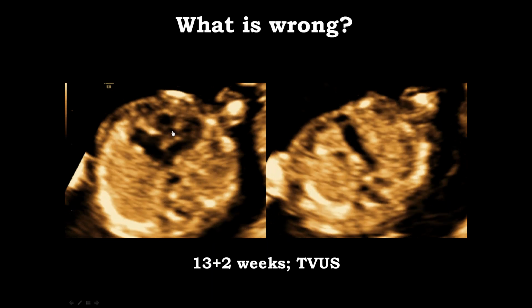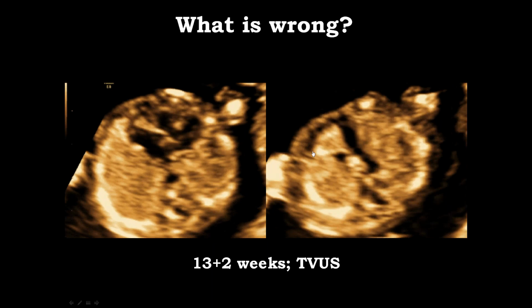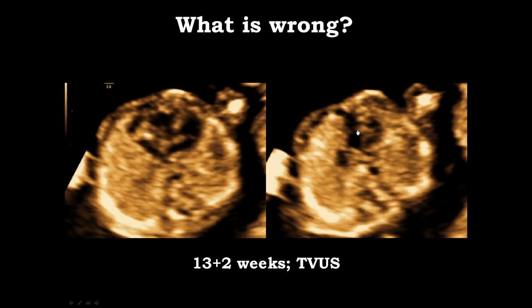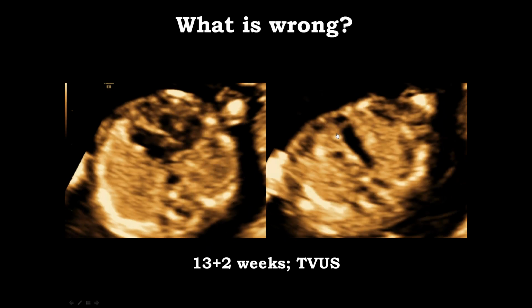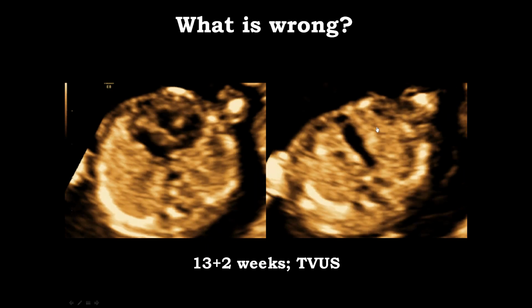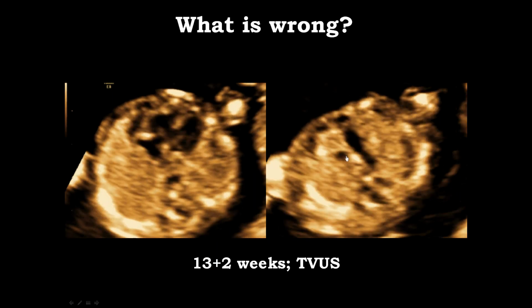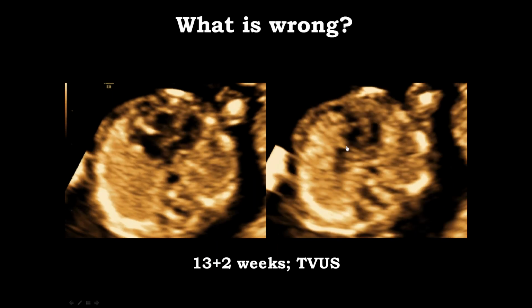And a major anomaly cannot be recognized here in the 4-chamber view. The major anomaly that we can recognize is demonstrated here in the 3-vessel and trachea view. Indeed, on this sweep, through the entire sweep up and down, we can see vessels merging together. We cannot see any difference in the appearance of the pulmonary artery, aorta, and superior vena cava. We can see the vessel here that seems to be bifurcating, and then we have the vessel that goes straight, and we have the superior vena cava on top. And this is what's typical for transposition of the great arteries.